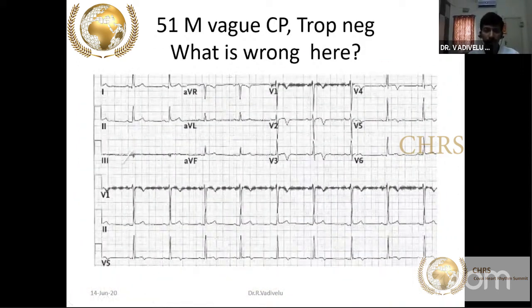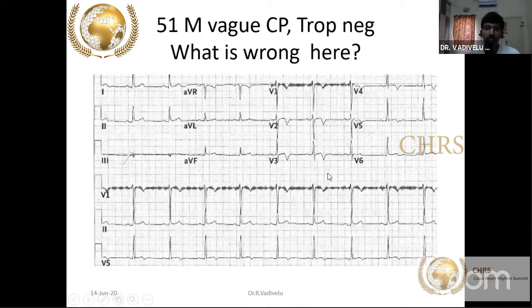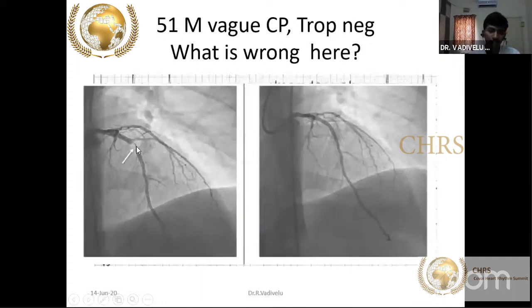A 51-year-old male presenting with chest pain, troponin negative. In V1 to V3, there is a biphasic T wave pattern — slight upright followed by T wave inversion — which can also disappear dynamically. This is Wellens syndrome, and angiography revealed 90–95% proximal LAD stenosis after the diagonal, confirmed after stenting.